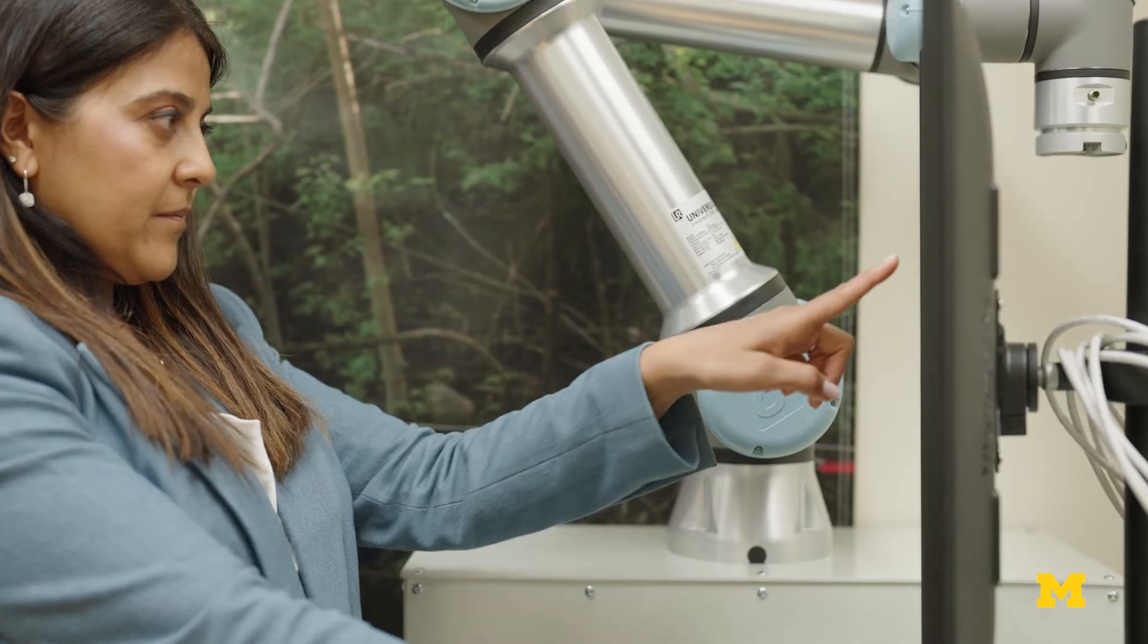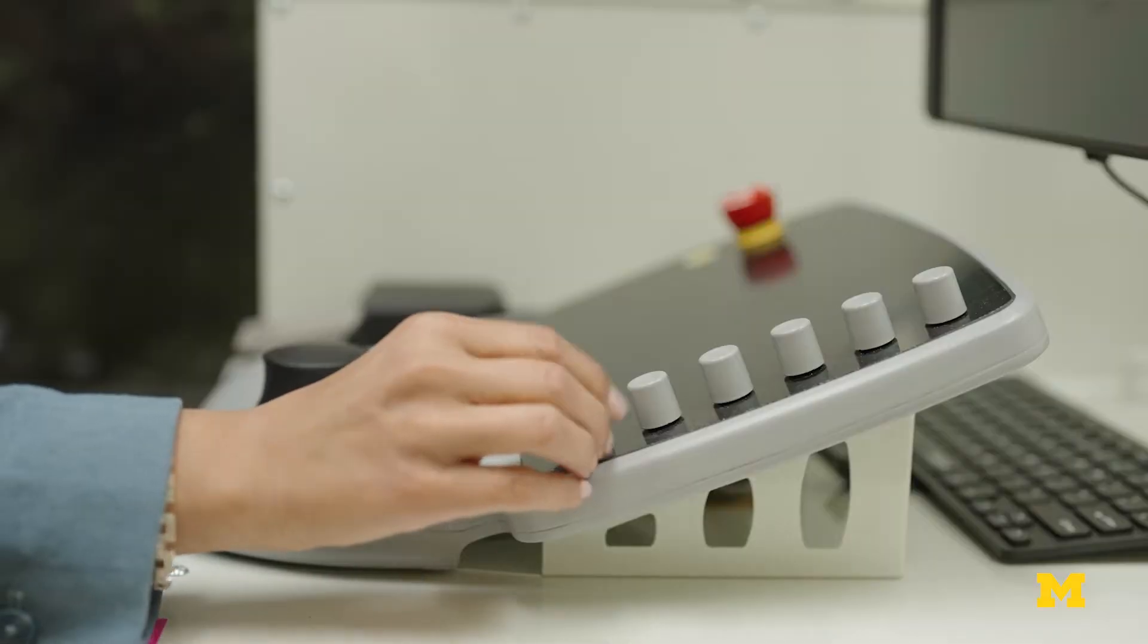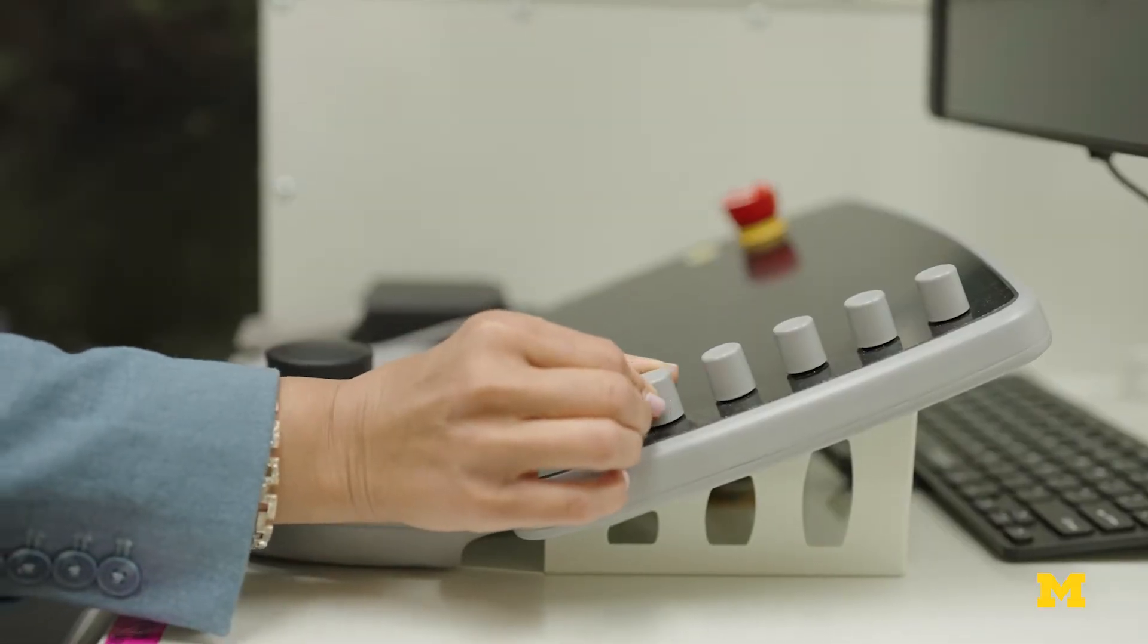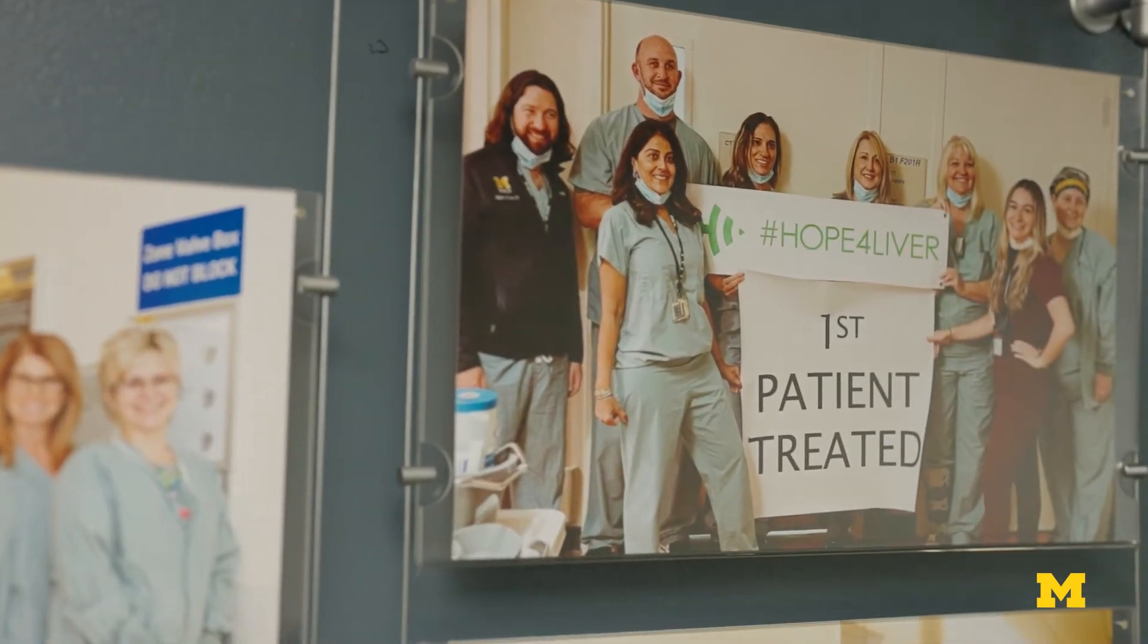To show its effectiveness, histotripsy was used to treat patients with primary metastatic liver tumors across Europe and the United States during the Hope for Liver clinical trials.